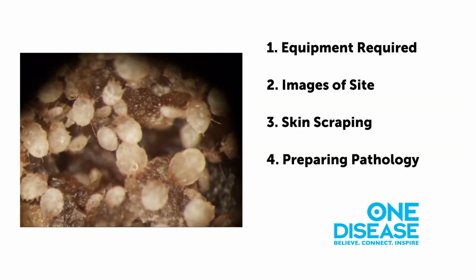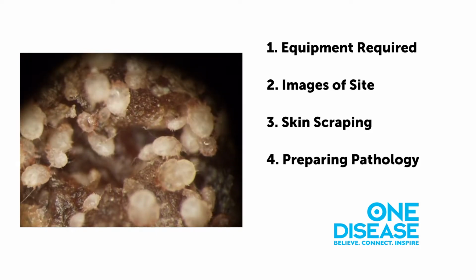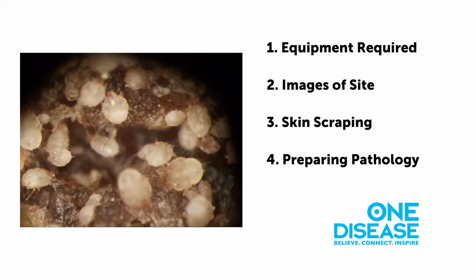This video will outline the specifics of performing a skin scraping procedure, including the equipment required, gathering images of the site, conducting the skin scraping, and preparing the pathology.